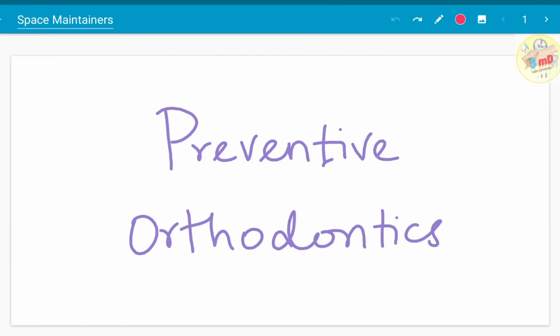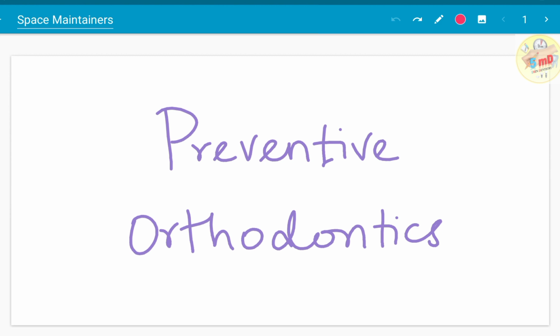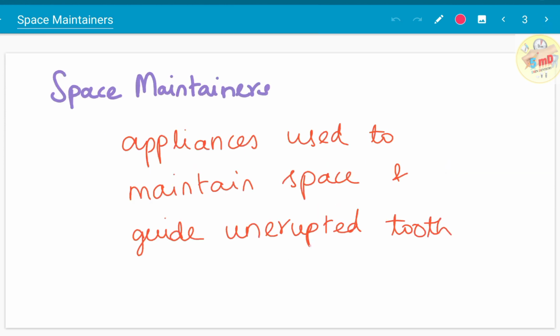Hello all. In this video we will see about one of the important aspects of preventive orthodontics, that is space maintainers. Preventive orthodontics, as the name suggests, in simple terms aims to prevent a problem before it occurs. For example, space maintainers are used when there is premature loss of primary teeth. The space needs to be maintained before the permanent teeth erupt in the allotted time for it. So the space maintainers maintain the space, thus avoiding crowding in the region.